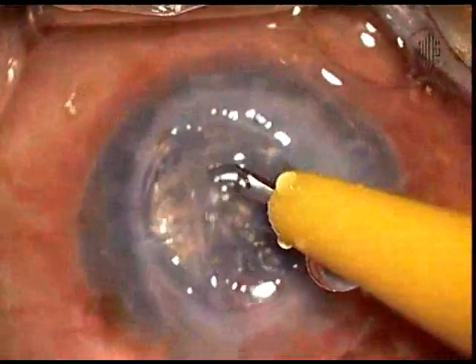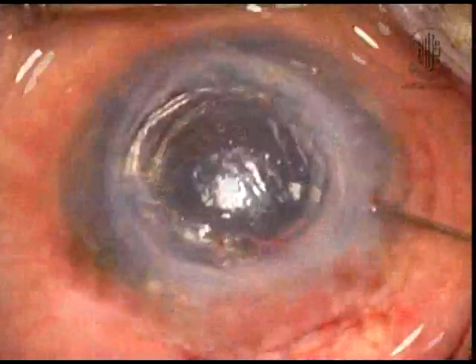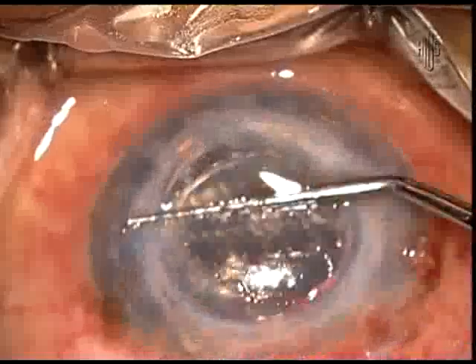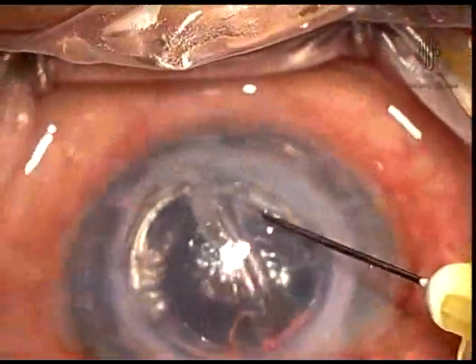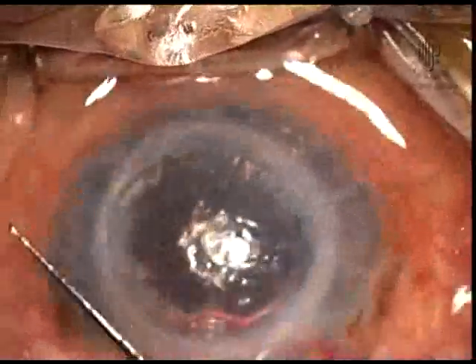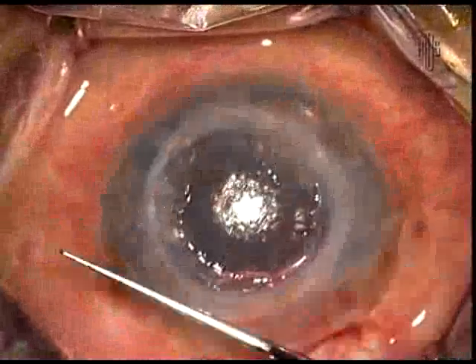Even if it doesn't help, external manipulation by side port blade and finally with a 30 gauge straight needle may be used for perfect centering. Gentle massage from external surface is still important to remove any folds created during this manipulation.